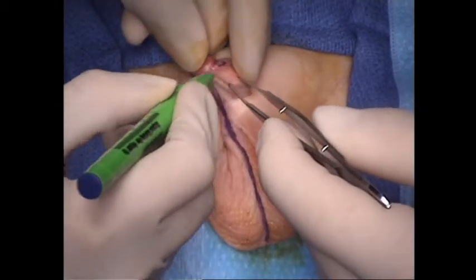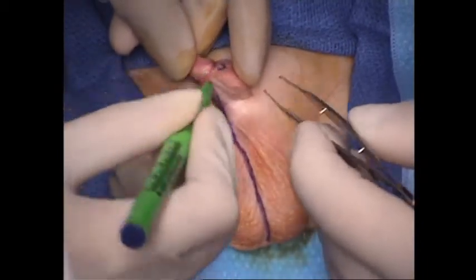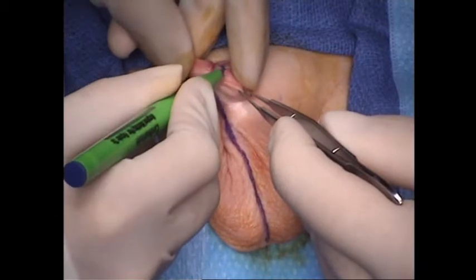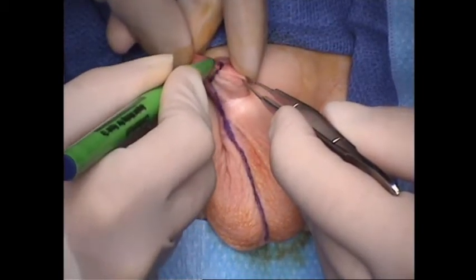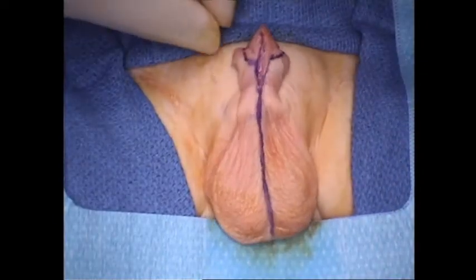Now right here, you can see that this is more attached to the glans, and so we're going to bring this out just a little bit so that we can keep a symmetric distance from the glans penis all the way around.